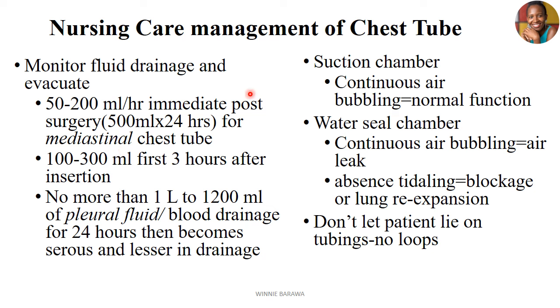In the suction chamber, the bubbling means normal functionality. But in the water seal chamber, the bubbling means there's an air leak. However, if you don't observe any tidaling in the water seal, it basically means there could be a blockage happening or a lung expansion that has already happened.